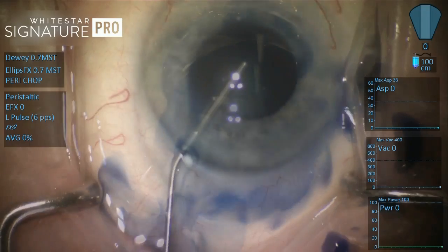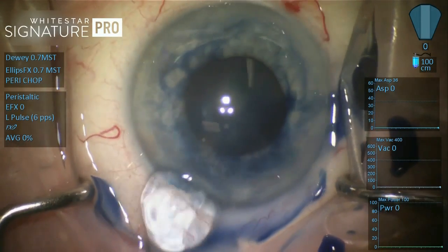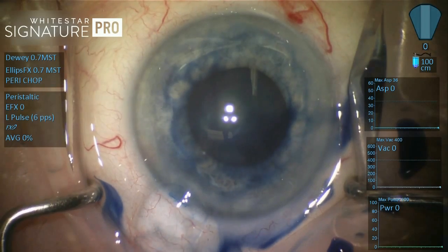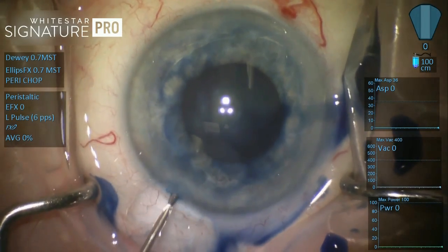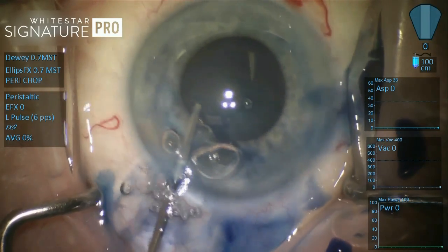So as is the case with these exceptionally dense cataracts, we're going to use trypan blue to give ourselves good visualization of the capsulotomy. Now I'm doing viscomydriasis here, and I'm really trying to assess how easily I'm going to get in the Malyugin ring.